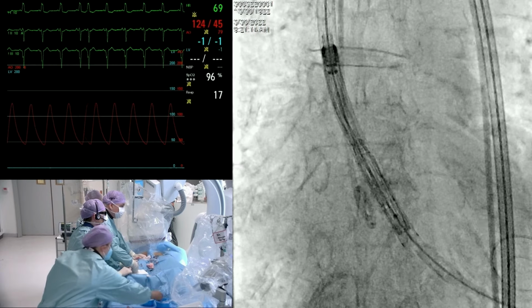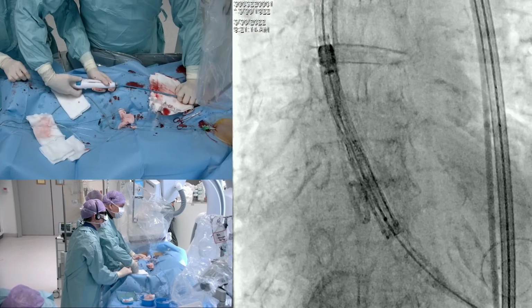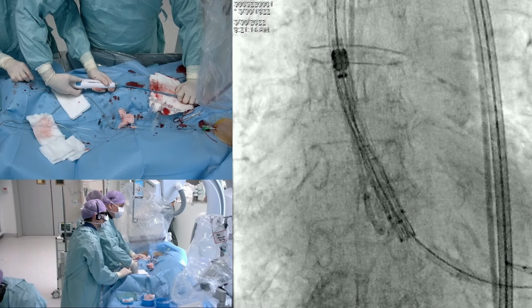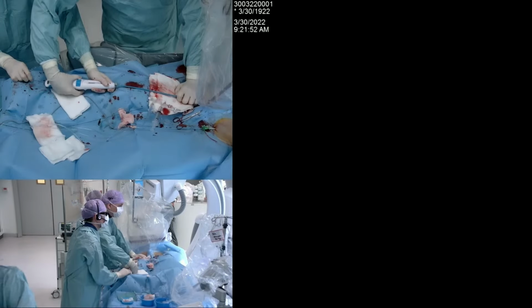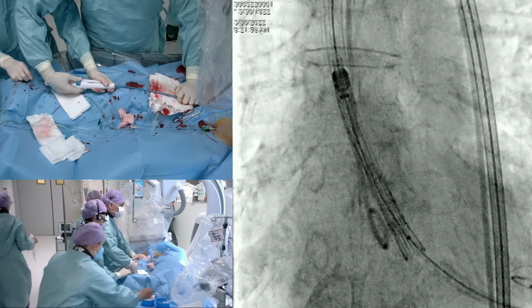So if it's diving down, Ole is pushing a little bit up on the guide wire. And I think it's also going to lock the system here on the guide wire. So you'll see very little movement during deployment as I push a little on the wire. You see the marker point is now just at the bottom of the non-coronary cusp. At the first intersection, we can do one more test. That's good. I think that looks fine.